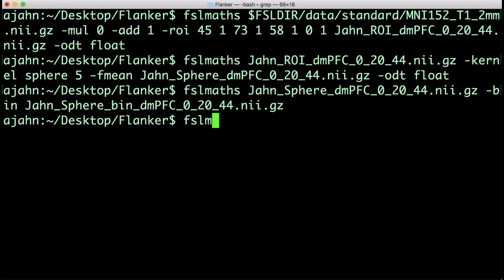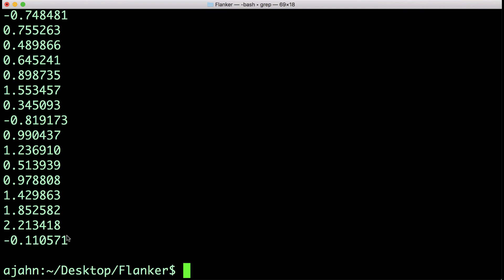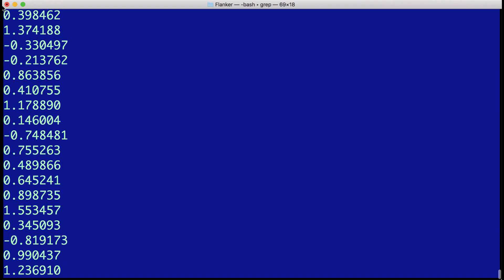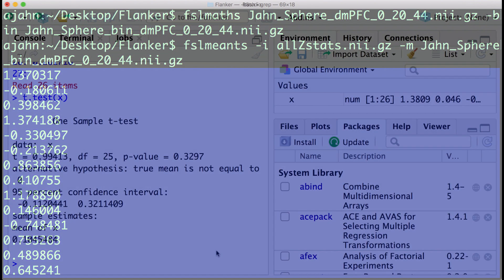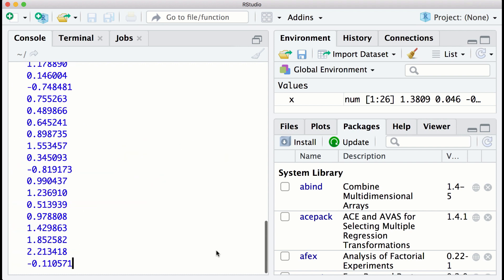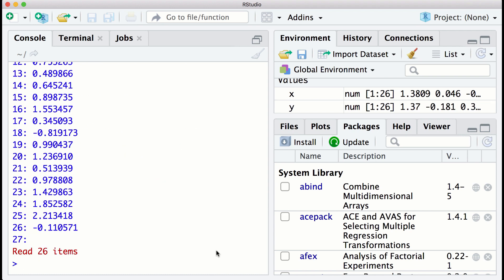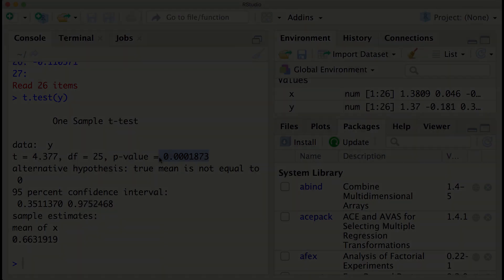Lastly, we will extract data from this ROI by typing the following command. You can then copy and paste these numbers into R and run a one-sample t-test. Because this ROI is more localized, we have more power to detect the cognitive control effect. And with that, you have completed the fMRI short course.